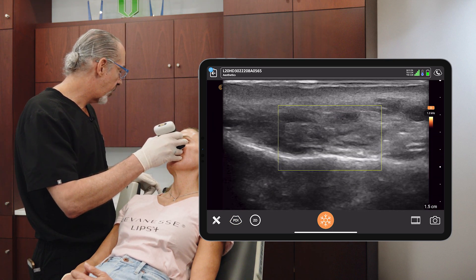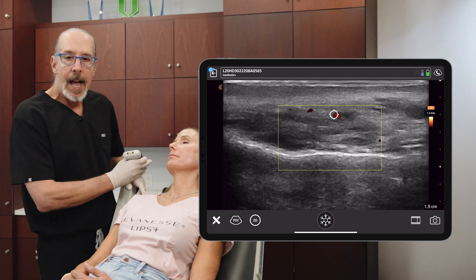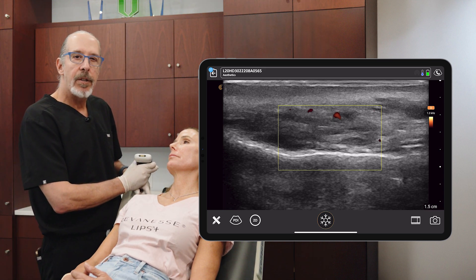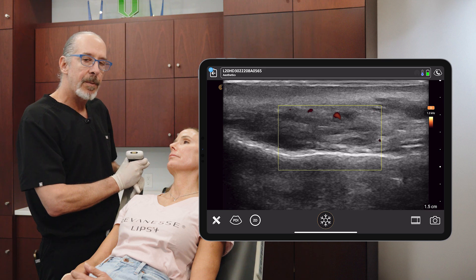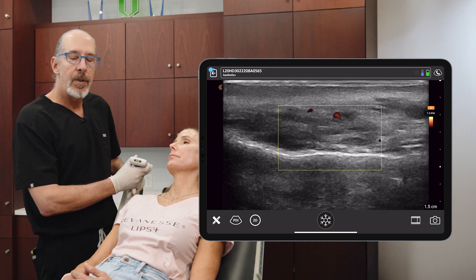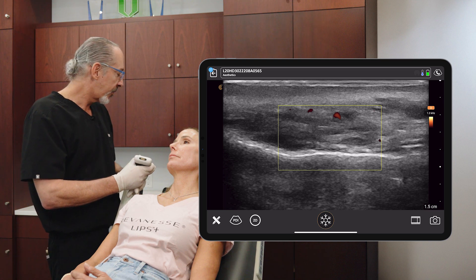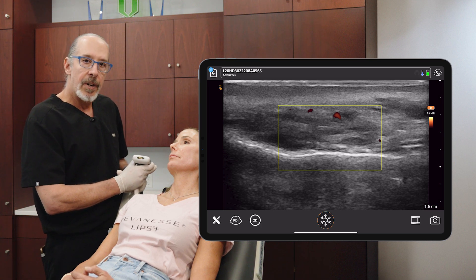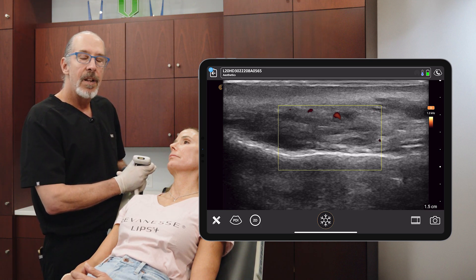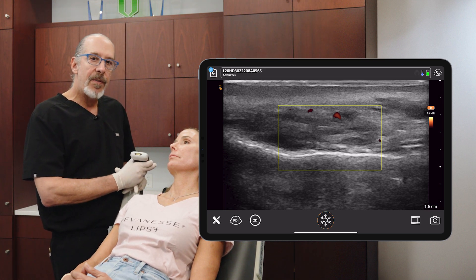What we see here — the main angular artery is right here. The criterion I use is: if the artery is more than 1.5 millimeters off of the bone, then it's safe to go deep onto the bone with your injections. If it's less than 1.5mm, I recommend choosing an alternative method — namely using a cannula in the subcutaneous plane, which is a very safe approach. Why 1.5mm? Because the bevel on a needle you'll be using is typically 1.5 millimeters in length. So even if you're on the bone and below the artery, the bevel could still be within the artery. So 1.5 is that criteria.